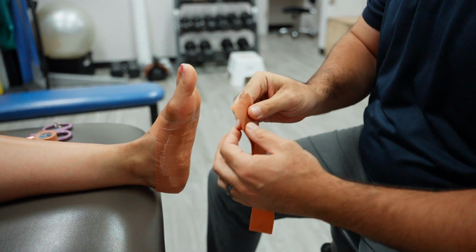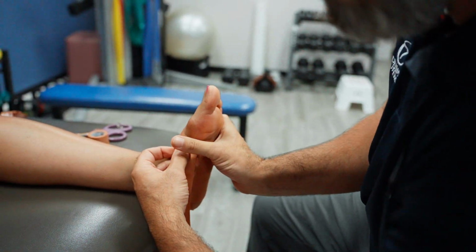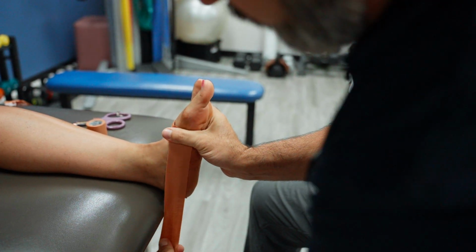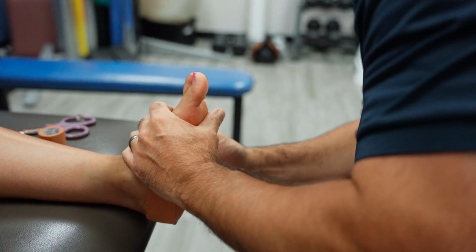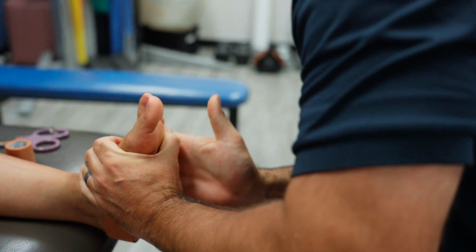I'm going to put another horseshoe on there. Same thing, I'm going to start on the inside of the foot. I'm going to pull down nice and loose across the heel, and then pull up tight.